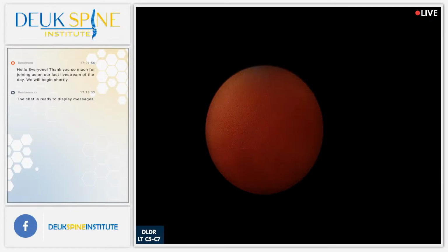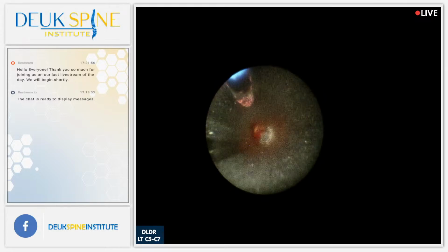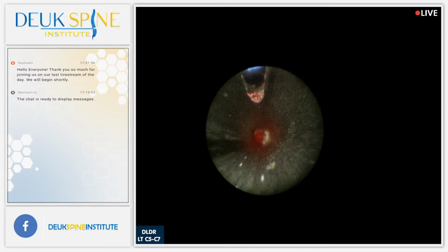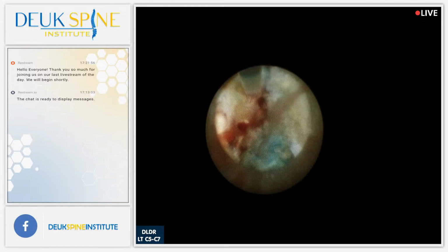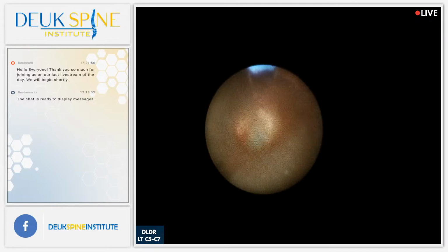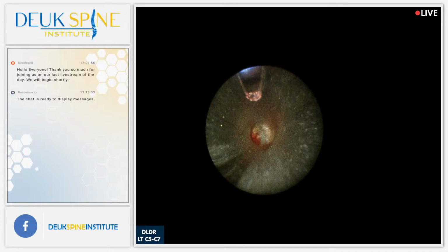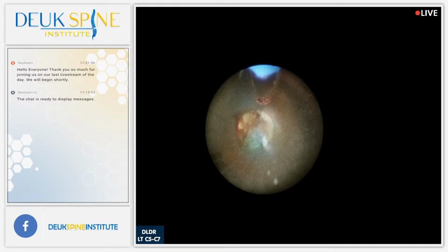All right. Where's my irrigation? Huh, it's weird. There's not much. You sure the irrigation is not really good? No? There's very little here. Let's flip it.